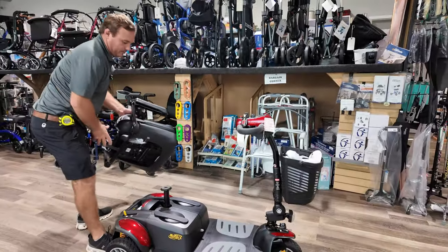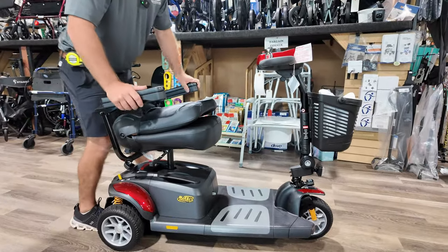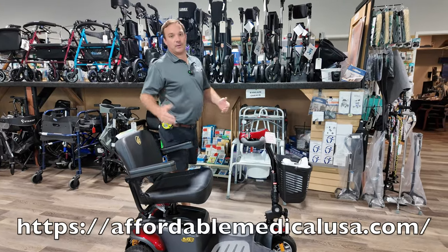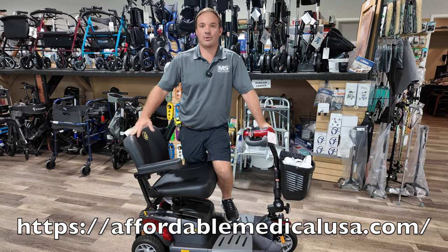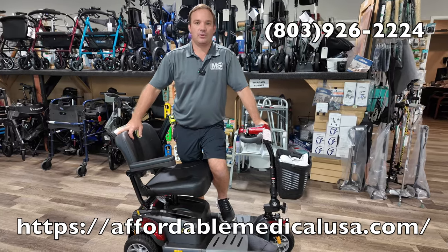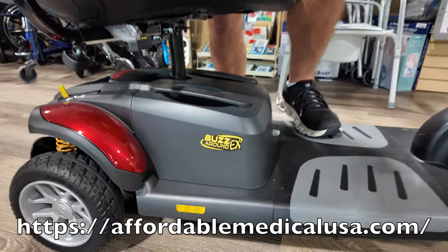Here's how you put the basket on the front. Then grab your seat and drop it right on. This might not be the right scooter for you, but we have other scooters. If you have any questions or want to know more about this scooter, visit us online at AffordableMedicalUSA.com or give us a call at 803-926-2224. This is the BuzzAround EX in the three-wheel configuration.